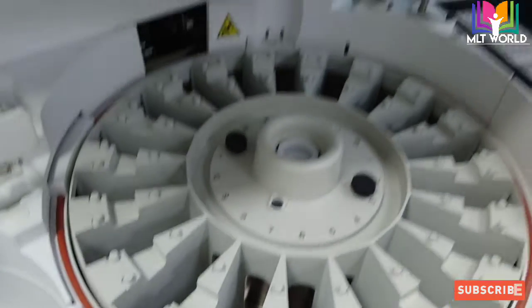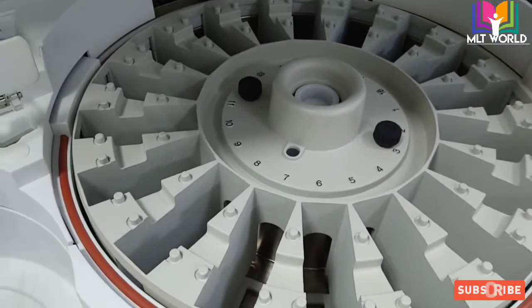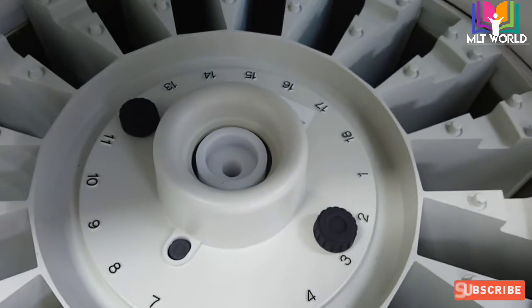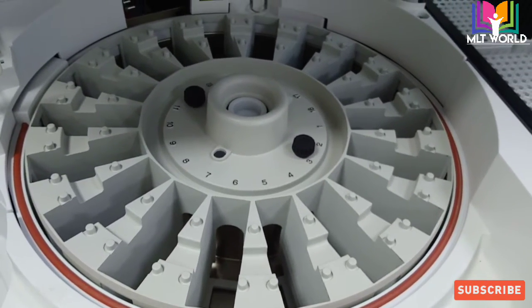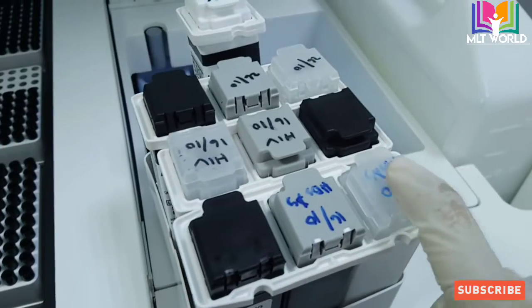This is the reagent area — on the underside there is a cooling system already installed. At one time we can keep 18 reagents in this machine. Some tests require two reagents, but most are single reagents. For example, HBsAg and HCV use a single reagent, but for HIV there are two reagents.